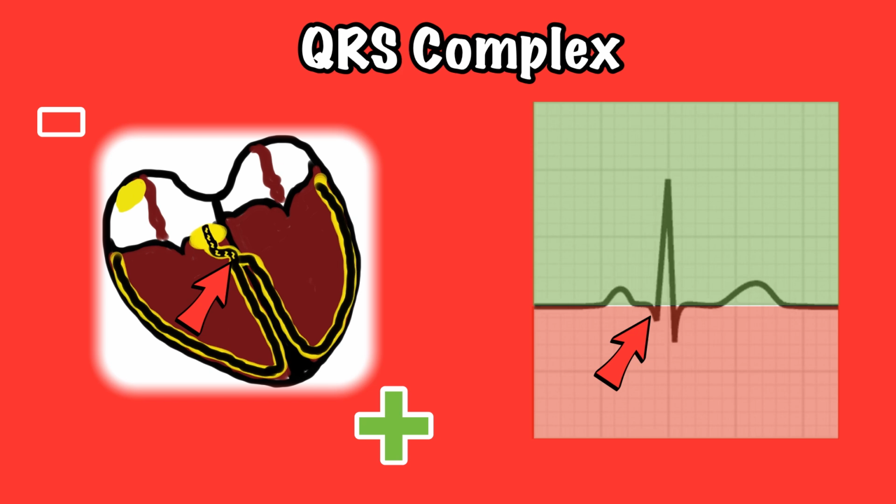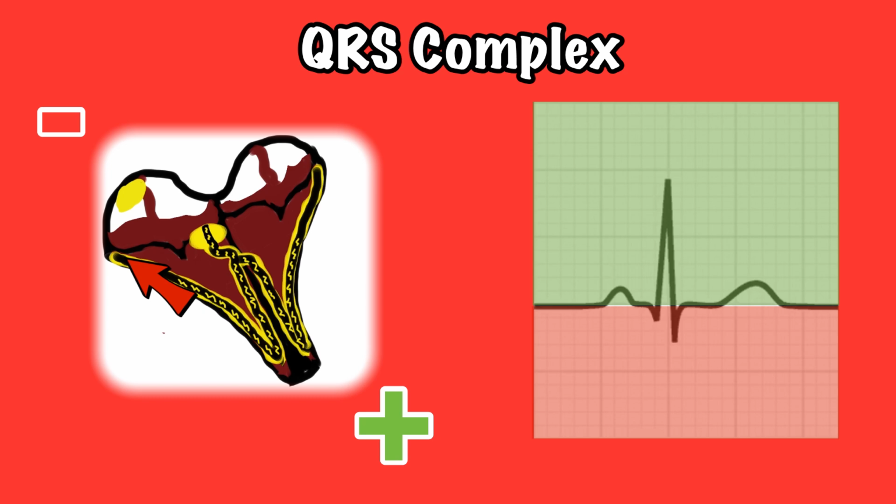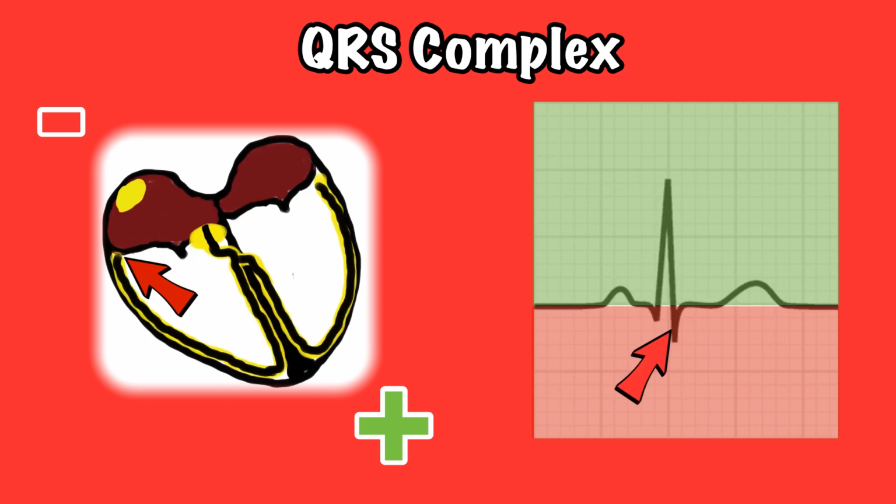And unfortunately, my picture doesn't do a great job of depicting this. The initial direction of the bundle branches is aggressively down, toward the positive pole. There is a lot of space here and a lot of cells to release energy. So we end up with a very large amplitude, positively inflected spike. But then, the bundle branches reach the bottom of the ventricle, and they turn, curling up toward the top of the heart, toward the negative pole. So we again see the tracing become negatively inflected, depicting that change in direction of depolarization.